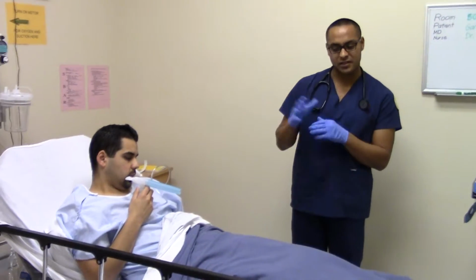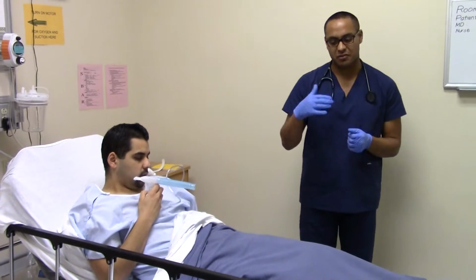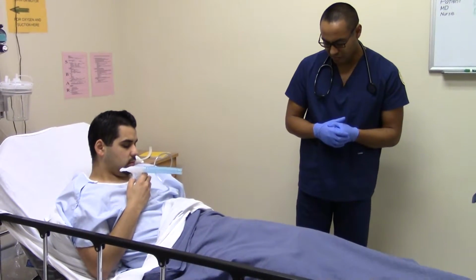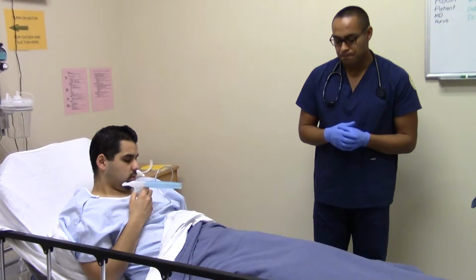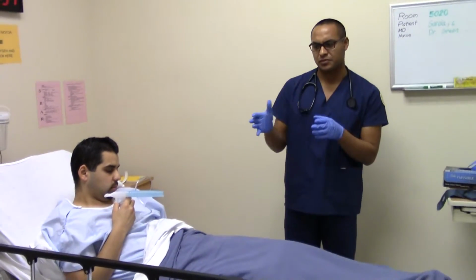He's using the mouthpiece. It's good. Patient's healthy. I'm watching the stats. So back in patient mode. Well, I'm watching the stats as this goes on. This is me saying time goes by. Time has gone. Treatment is over now.